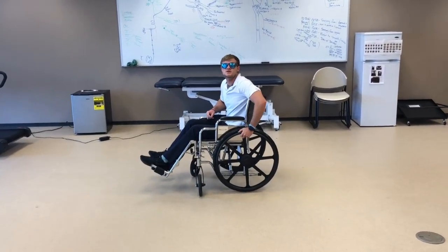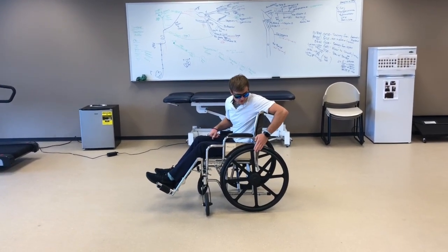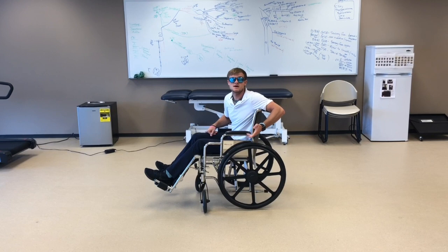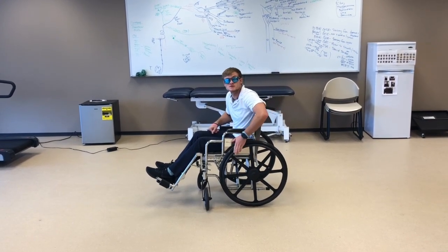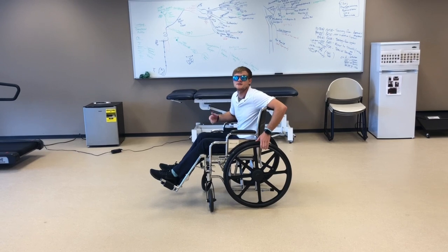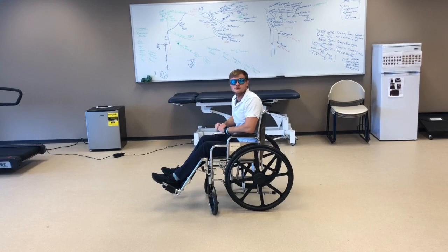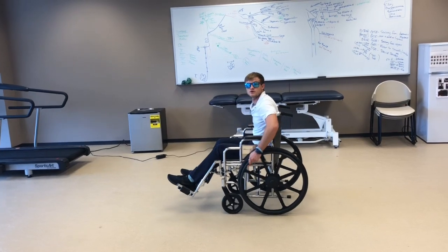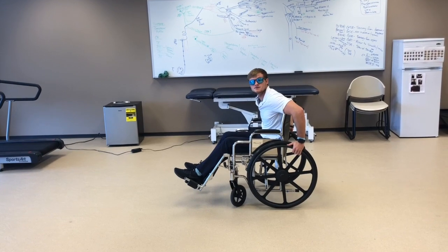Right here, this is a push rim. This is what you're going to use to propel the wheelchair forwards and backwards. We're going to use this as a clock — it's going to have numbers, but opposite from a normal clock. So this is 12 o'clock, this would be 1, this would be 2, so on. This would be 10, and this would be 11. To go forward, we're going to start our hands at 10, go to 2, and that's what causes us to propel forward. You want nice, long, smooth strokes, and then let go at 2.